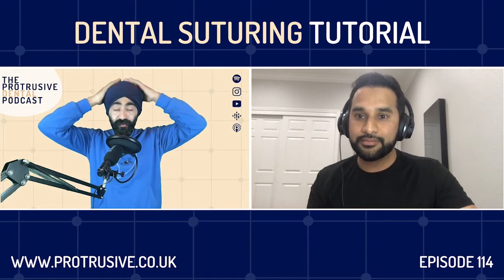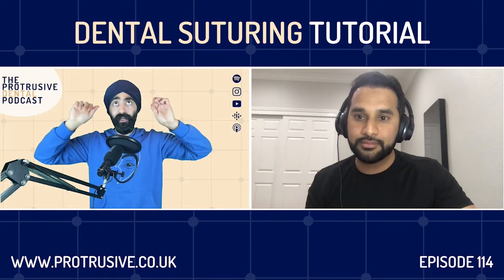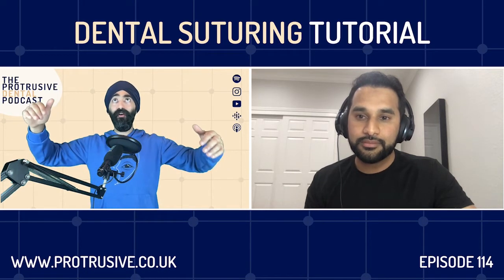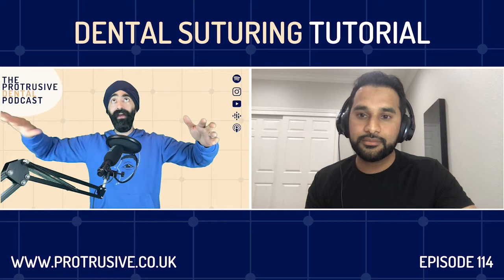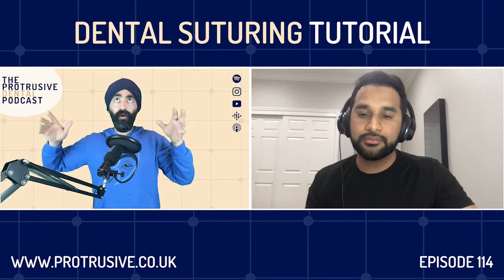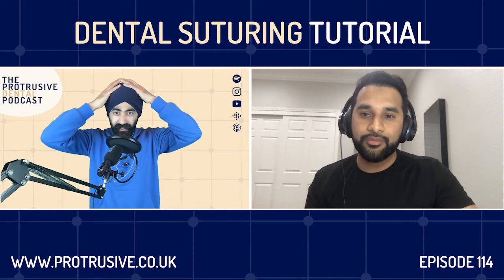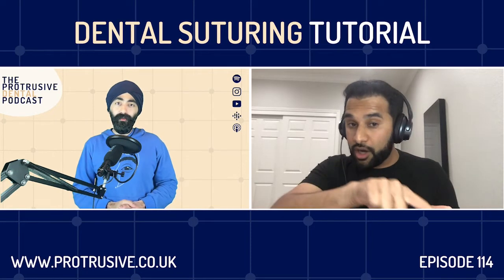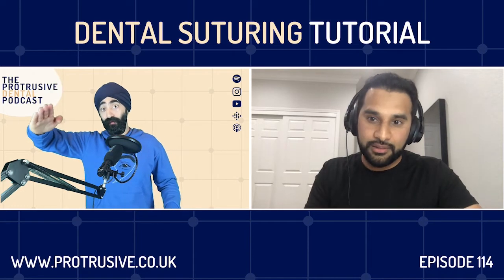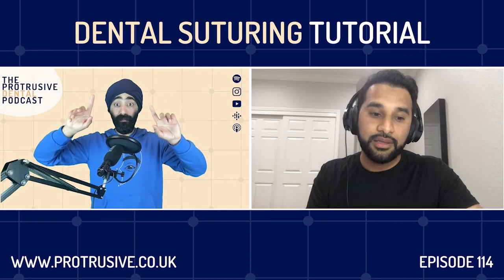So back to the question I was going to ask you. Crown lengthening, functional crown lengthening on the palatal side of the upper canine to canine, and you've removed some bone and cut some gum away, and now you're approximating the tissues back. Obviously, cases vary, but what kind of suture would you use for that case, if you were to visualize it now? So, straight across canine to canine? Yes, correct. I scalloped. I removed about 2 millimeters of gingiva, a scallop on the palatal side. I did not raise any flap labially, just palatally.